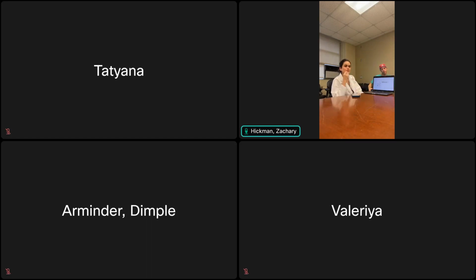It matches up with the arterial waveform, at least P1 and P3 do. The usual waveform that we look at is correlated, as we just said, to the cardiac system, arterial compliance, how the brain is doing with that increase or decrease of pressure, and the venous component.